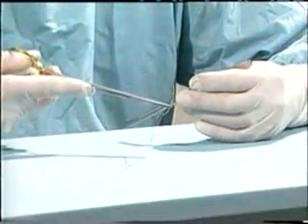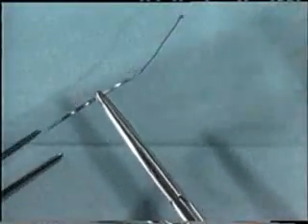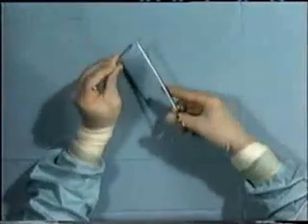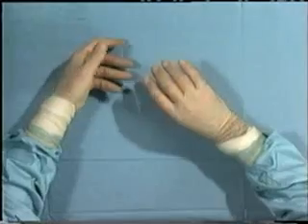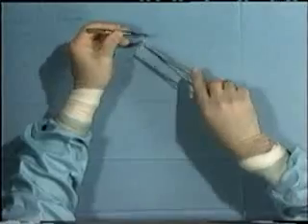Insertion of sutures requires a smooth supination of the forearm, but occasionally a backhand suture is required, in which case the needle position can be changed in the needle holder, enabling you to insert a backhand suture. This is an exercise of forearm manipulation, with one arm pronating and the other supinating synchronously. Watch again. One arm is pronating while the other arm supinates, and therefore the needle can be changed from the forehand to the backhand very simply and efficiently.